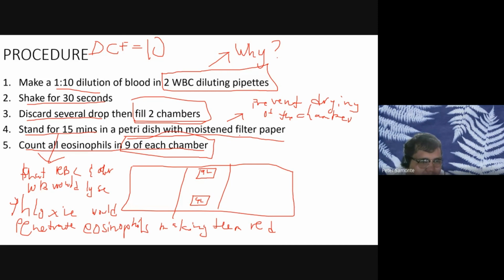No, not 18. Why 225? You're not going to count the medium square. You're just going to count the entire large square.